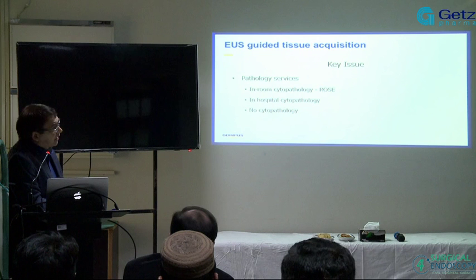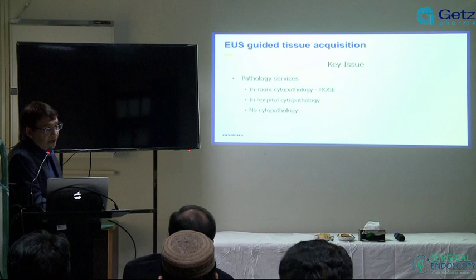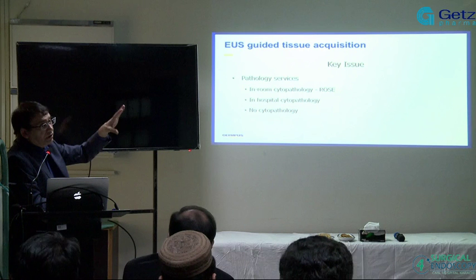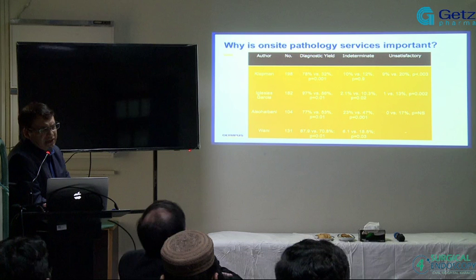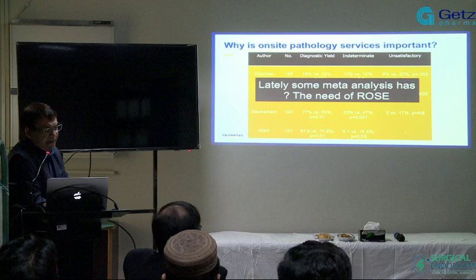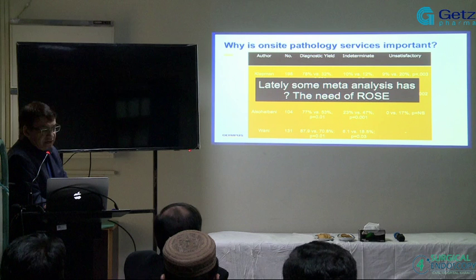And the third, which is the majority of the cases, especially maybe in this part of the world, is that you don't have really accessible cytopathology services. Okay, so all these factors matter. All these factors help you choose what type of needle you should be using. These are the studies which did show that having an on-site cytopathologist does help. But lately, after the availability of the core needles, there's a meta-analysis that is kind of questioning, is there really a need for ROSE, or a need for having a cytotech in the unit.